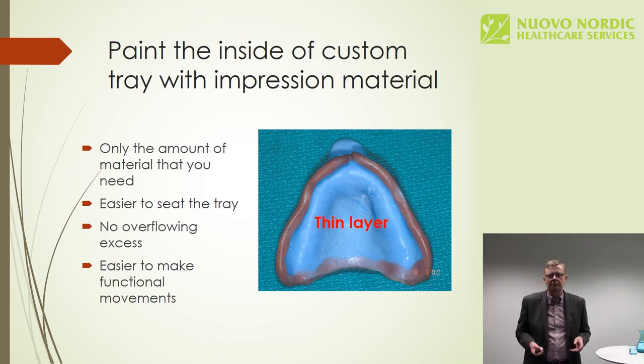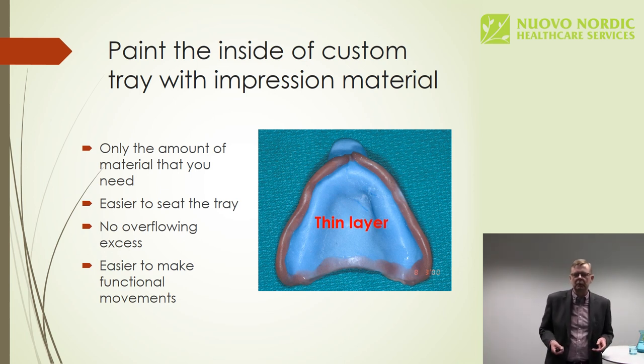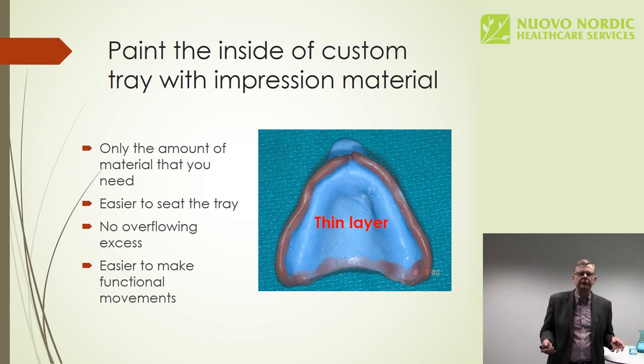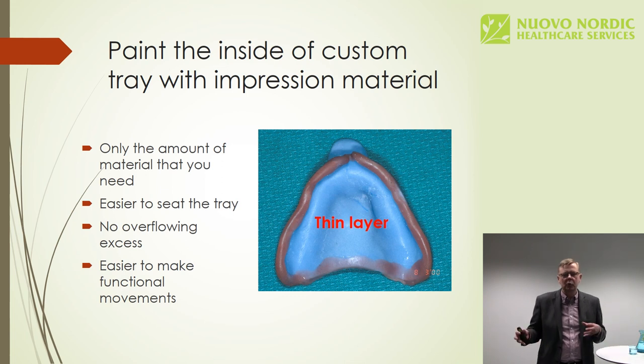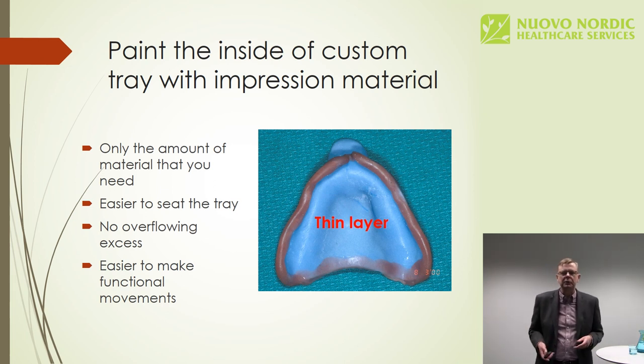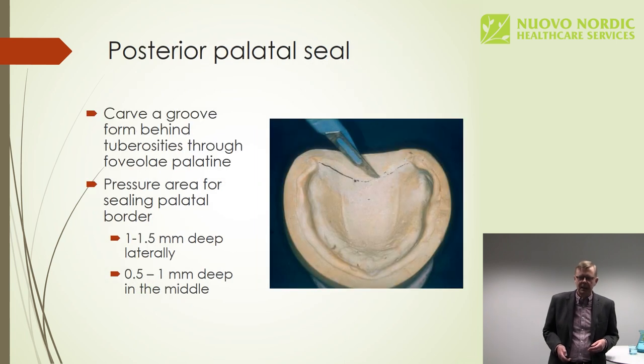The patient should make some functional movements, like sucking your finger, opening the mouth wide, and then moving the lower jaw left and right. In that way, he or she will shape the borders of the becoming denture.